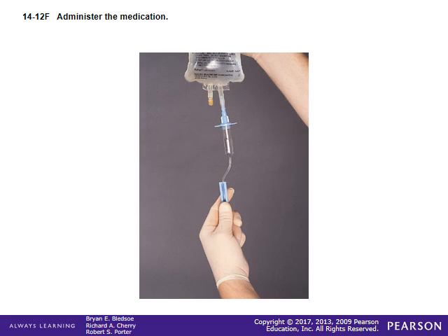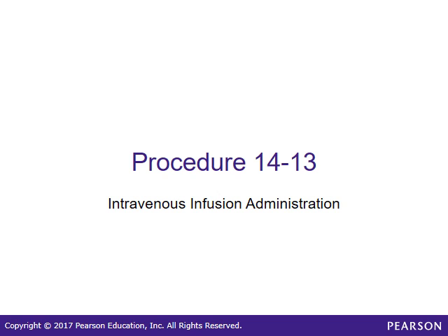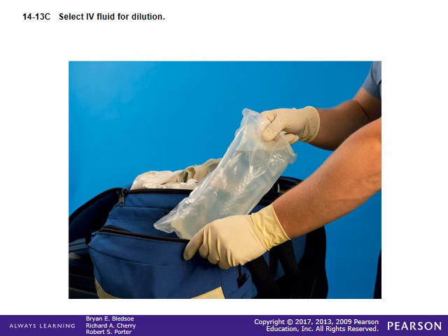Usually you will close off the clamp to the IV infusion bag when you're doing IV bolus medications, as well as pinching off the tube. Always monitor the patient before and after administration of medication. Remember also, when drawing up a drug and selecting the IV fluids to accommodate that drug, that you choose the appropriate one.